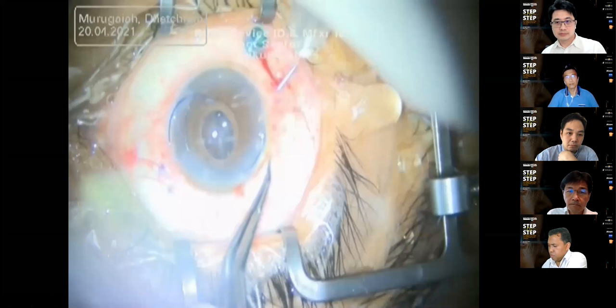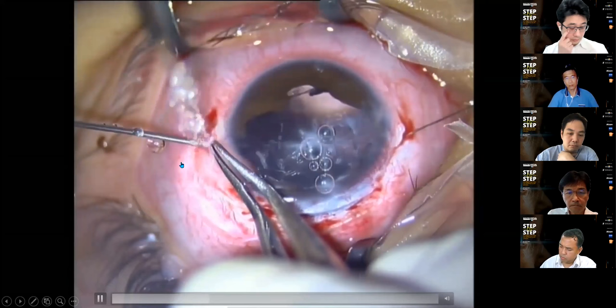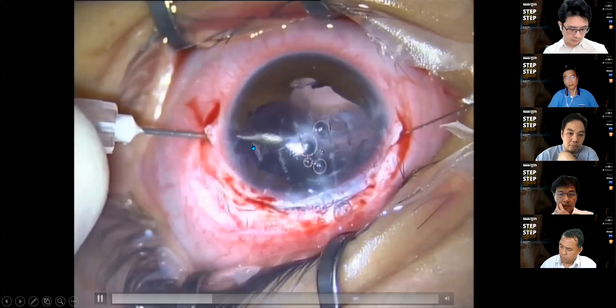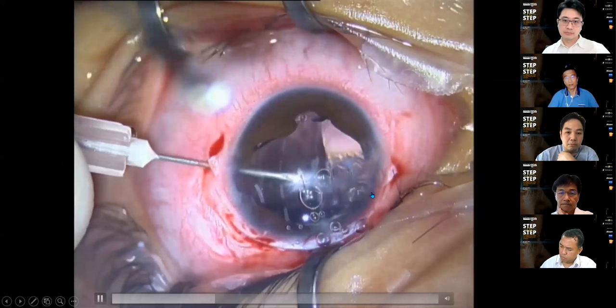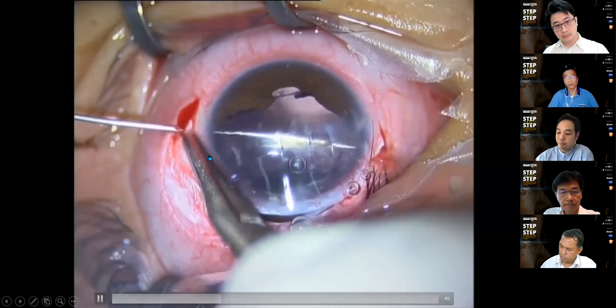So let's go back to our video. Okay. Now the insertion of the retrieving needle, again perpendicular. Once you can see the needle tip, you can bend it forward and introduce the straight needle of the Prolene. You push as much as you can. Hopefully it passes the bend part and forms a grip, and you can pull it out easily.